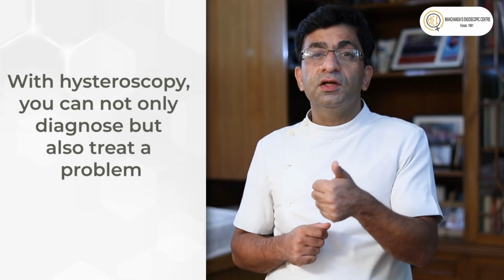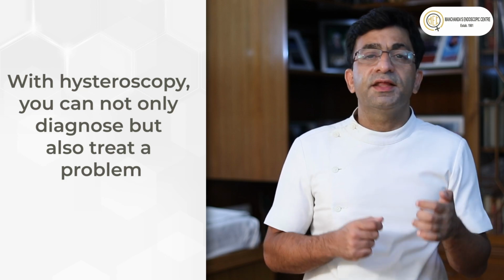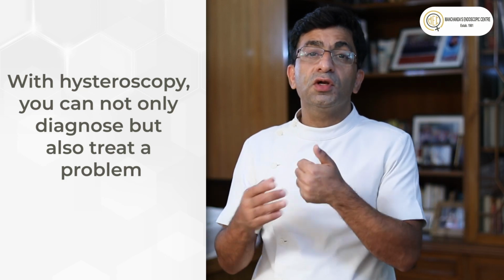It can be done under anesthesia, which most of us are doing, or, if it's a thin telescope, as what we call an office procedure. So you don't need any anesthesia, and it's not painful. So a hysteroscopy is when we put this telescope inside the uterus from below with a camera attached, and we look at a picture on the screen in order to diagnose the cause of why the lady is having a problem. And then you can treat it at the same time. So it's called see and treat.